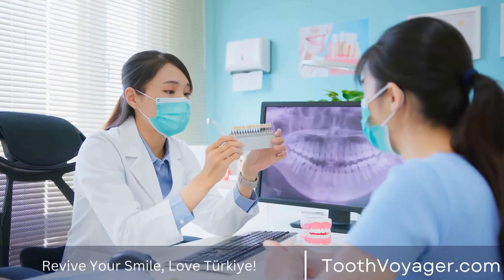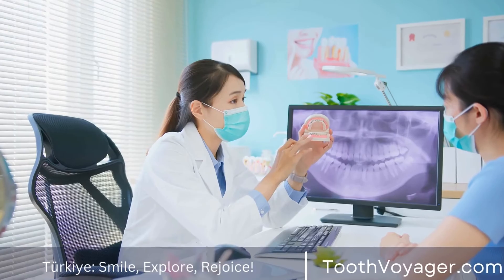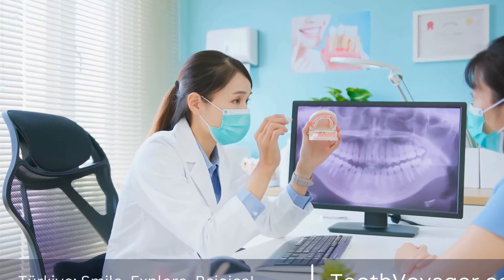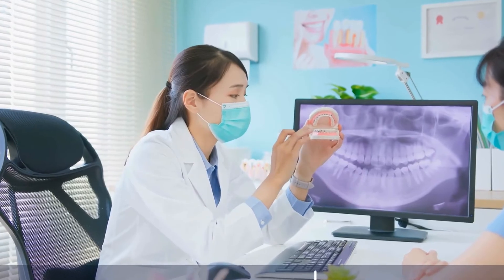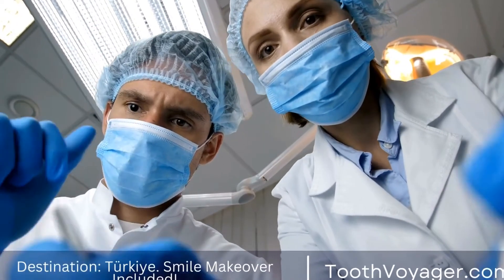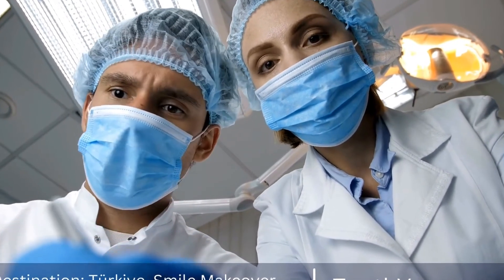All-on-4 dental implants are a revolutionary treatment option for patients who are missing all of their teeth in a single arch. This technique involves placing four dental implants in strategic locations in the jawbone to support a full arch of teeth.